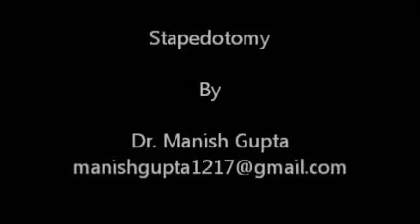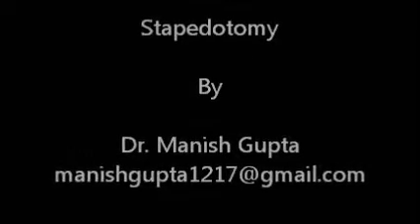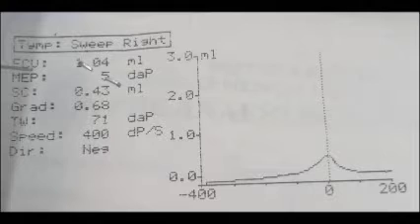Hello, I am Dr. Manish Gupta presenting here a Stapedotomy. This was the pre-operative audiogram of the patient showing a Carhart's notch and the patient having a mixed hearing loss with the air-bone gap on both sides. This is a tympanogram showing an AS type of curve on the right side.